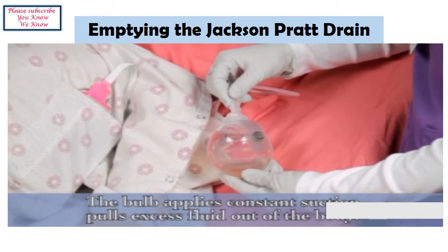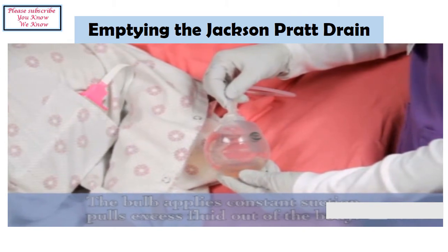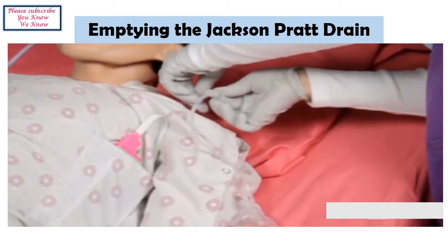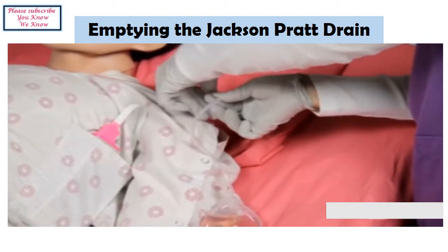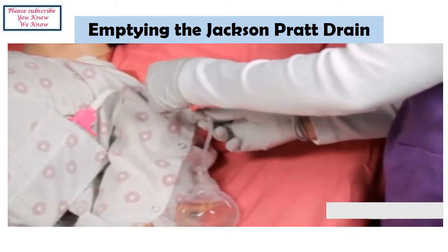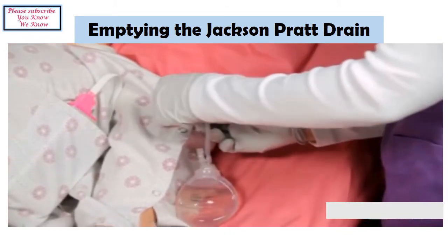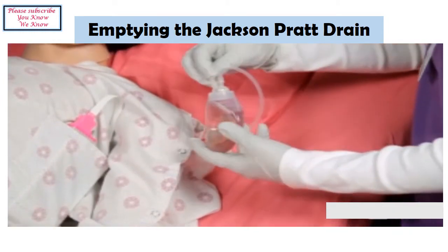To empty the Jackson Pratt, first of all we have to gently squeeze the tube between the thumb and index finger, moving the fingers along the tubing towards the suction bottle to help dislodge any obstruction or blood clot. We can use soap or liquid sanitizer to help the fingers glide over the tubing easily.